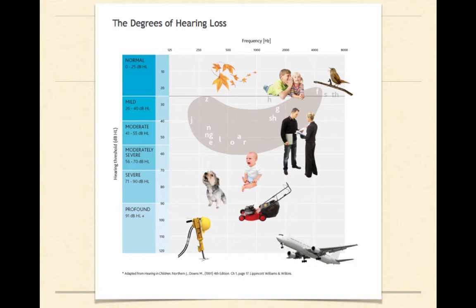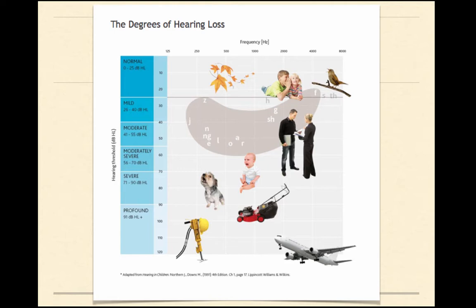In the moderately severe range, you're not even going to hear most of the speech sounds, because those fall in the mild to moderate range. As we move down to more of the severe range, you might hear a dog barking, you might hear a baby crying. As you move into the profound range, you might hear a jackhammer or an airplane, but you wouldn't be able to hear sounds above it, like a baby crying or speech sounds.